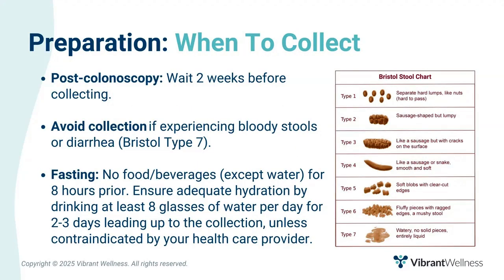It's best to collect a sample when fasting, so nothing to eat for 8 hours prior to collection, and also to ensure adequate hydration by drinking at least 8 glasses of water per day for 2 to 3 days leading up to the collection, unless fluid restriction is medically indicated. Patients should wait 2 weeks after colonoscopy, as colonoscopy prep dramatically changes the microbiome and it takes at least 2 weeks to return to normal.